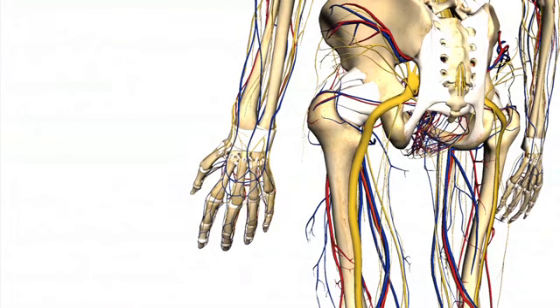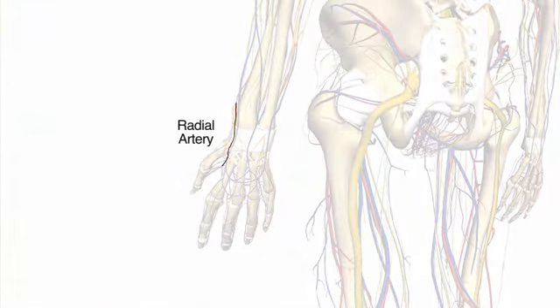It is important to avoid the arteries in the hand, particularly the radial artery, which has a large branch in the anatomical snuff box and could be punctured accidentally when trying to gain access to the cephalic vein. In the event of arterial puncture, there will be a high pressure release of blood from the site. If this occurs, remove the needle immediately and apply direct compression over the puncture site for at least 5 minutes. It is best avoided by checking for pulsation prior to insertion.